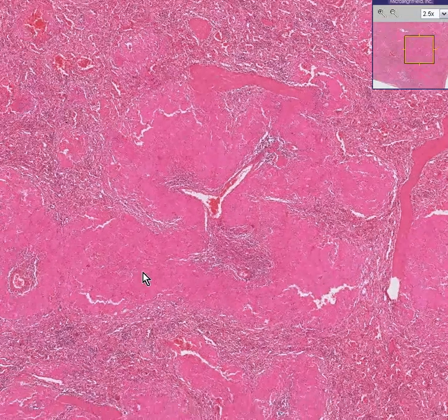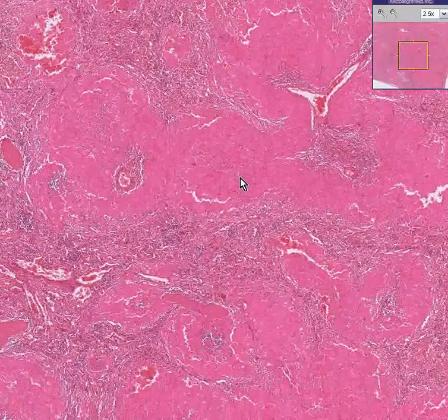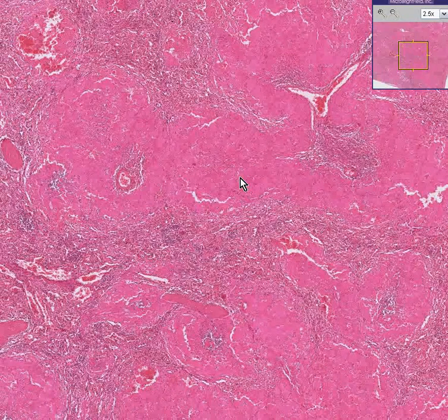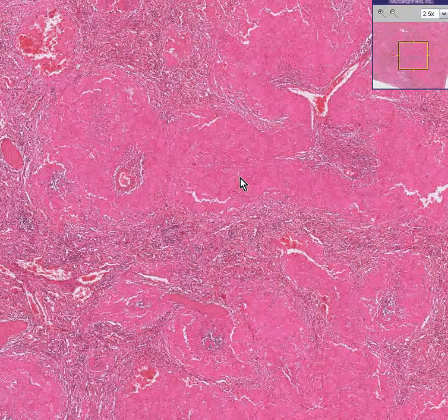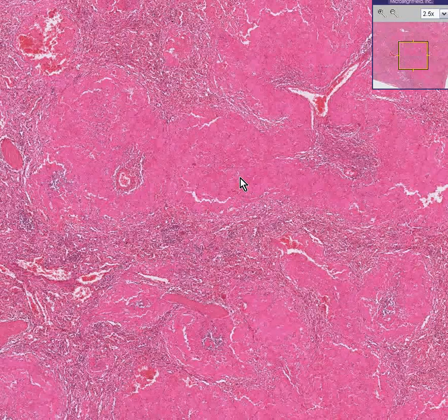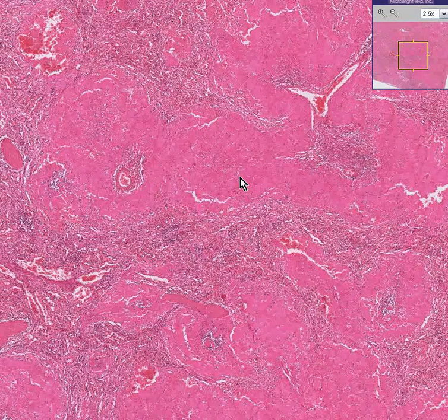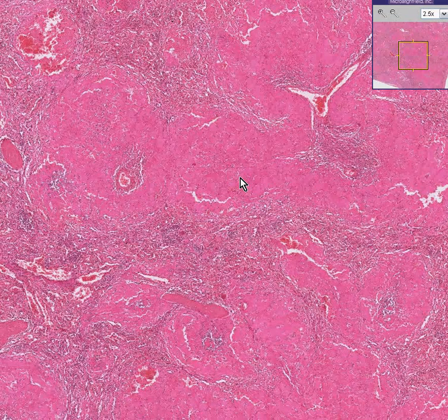This is amyloidosis of the spleen. Some people call this a sago spleen because there is a palm tree in the tropical parts of the world with a fruit called the sago palm. They actually eat the roots of the tree, and if you cut the root, it looks a lot like this spleen would look like.